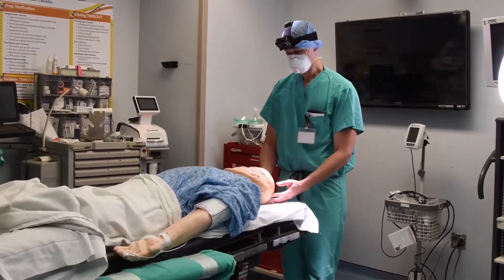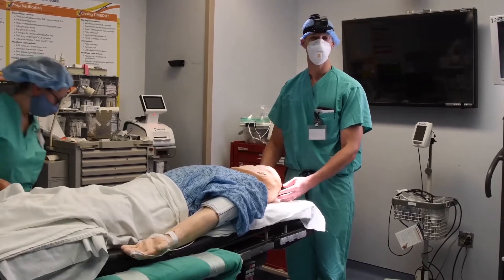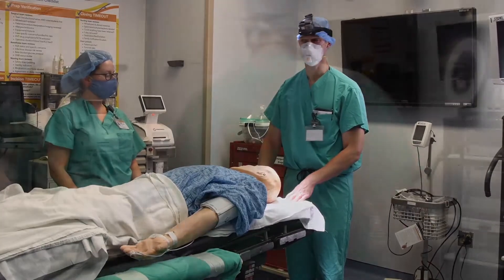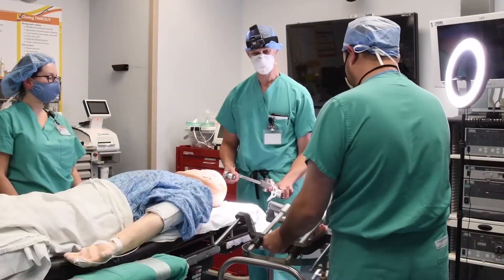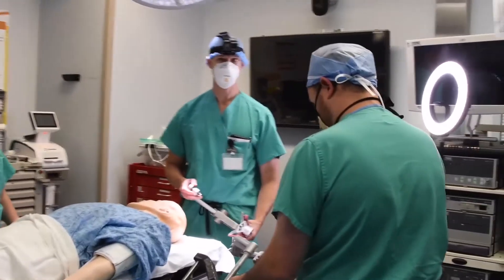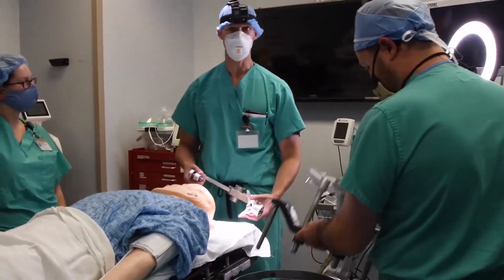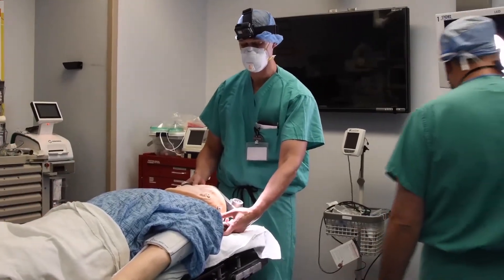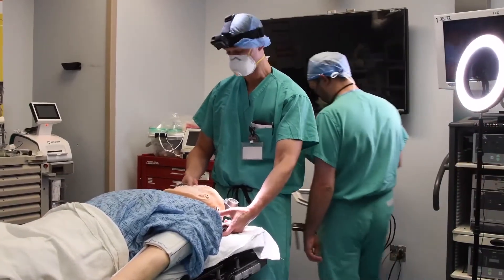There are two ways to pin: one is with the headrest on and one is with the adapter on. We're going to start by pinning with the headrest on. When pinning, especially for a skull base procedure, the things to think about are: where is your incision, and are your pins optimized so that you can get the head in position with the right surgical corridor?